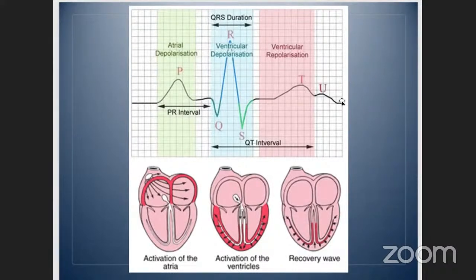Then repolarization, and why we always look at the ST and T and U segments when we are looking for dynamic changes or for acute coronary syndromes, is because the heart is very sensitive to hypoxia or hypoperfusion. And so any irritation or failure of that will cause them to repolarize abnormally. And so any changes with regards to the myocyte or injury to the myocytes would cause the fluctuations with regards to that. So it's always helpful to understand the physiology when we're looking for pathology.